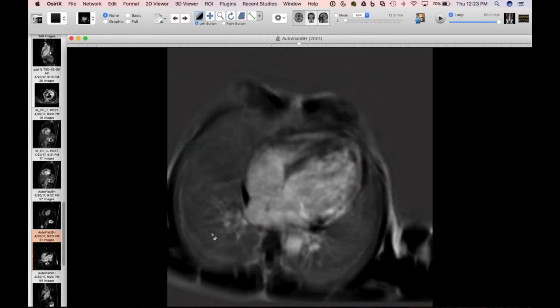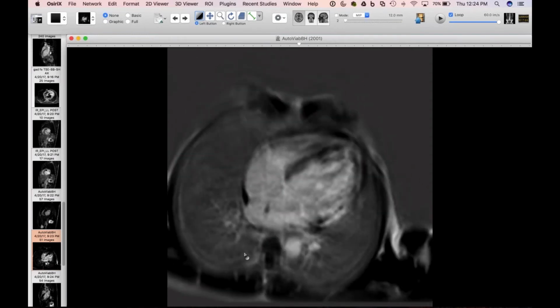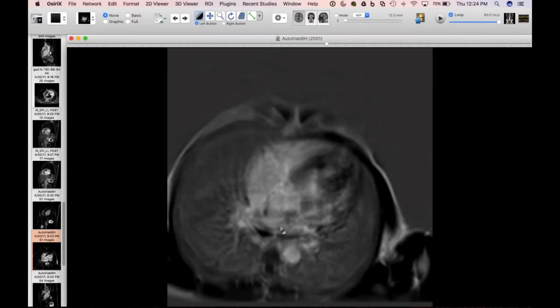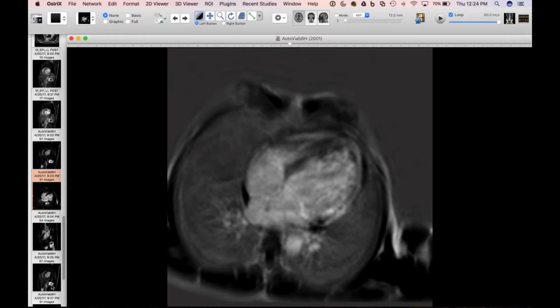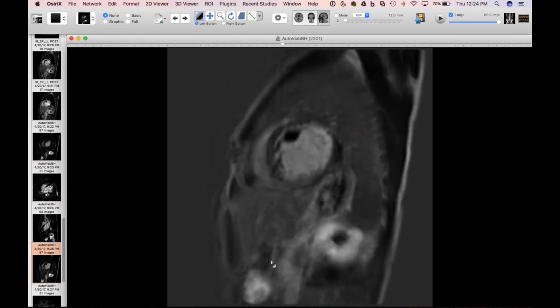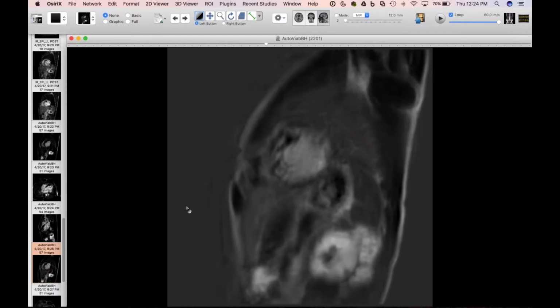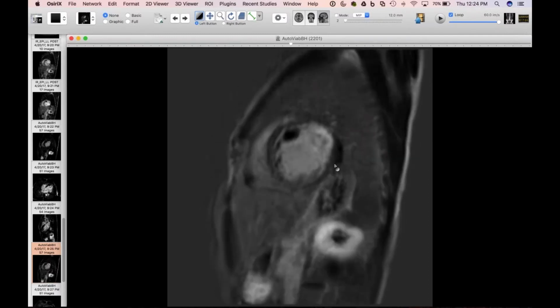I mean, there's HIV cardiomyopathy. I don't know if it's acute myocardial inflammation or chronic myocardial inflammation with virus or unrelated. I don't know enough about it to say. It's not an ischemic pattern. Yeah. I don't know enough about it, to tell you the truth, I should, given our population, about HIV cardiomyopathy and what the enhancement pattern is. Yeah, I don't either. It sounds like relatively recent onset of cardiac symptoms over the last couple of months. So they may, yeah.